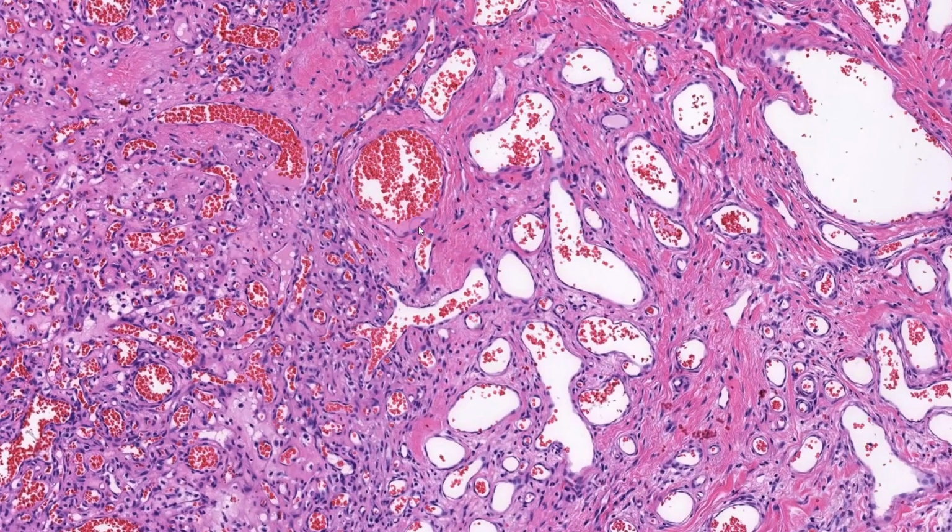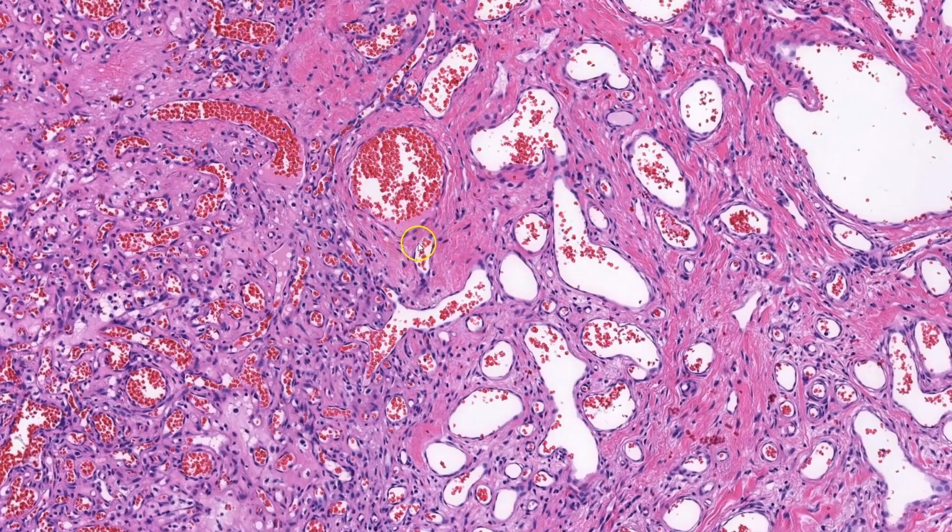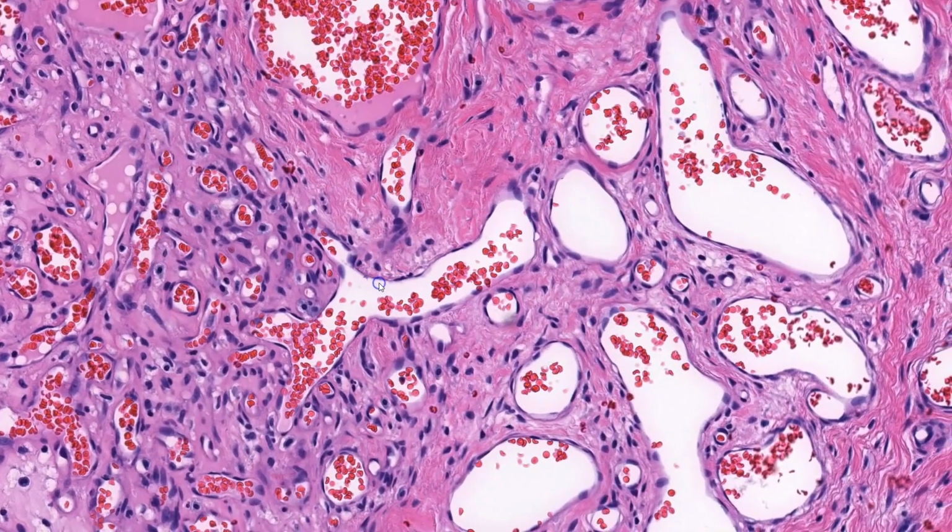Lastly, at high power, I see that the stroma is variably hyalinized with scattered chronic inflammatory cells. Lining the capillaries are a single layer of endothelial cells. These are largely flat, with small dark nuclei and minimal cytoplasm. If I scanned around enough, I could probably find some that are a little larger and protrude a bit into the vascular lumen, but I wouldn't see any atypical cytologic features.